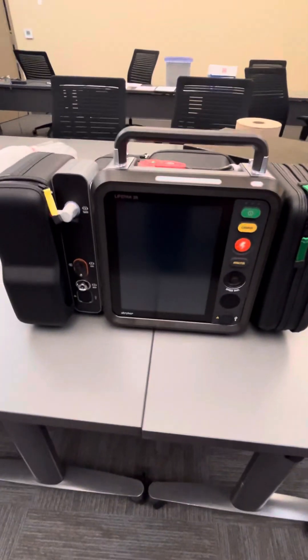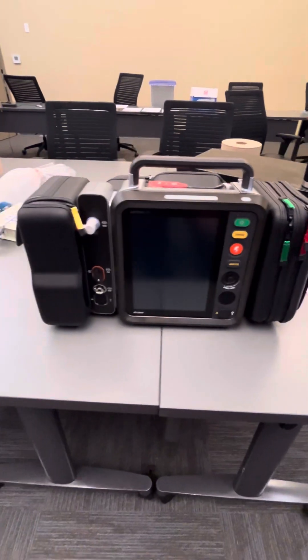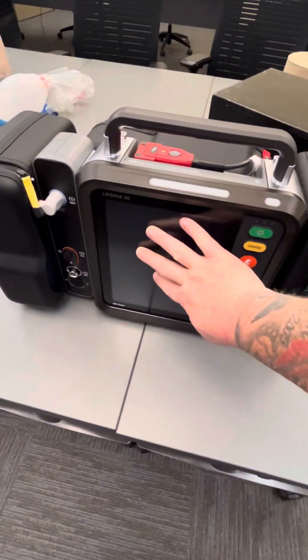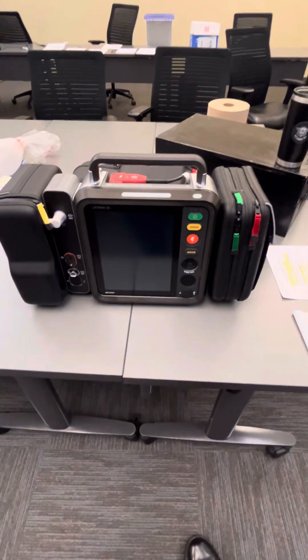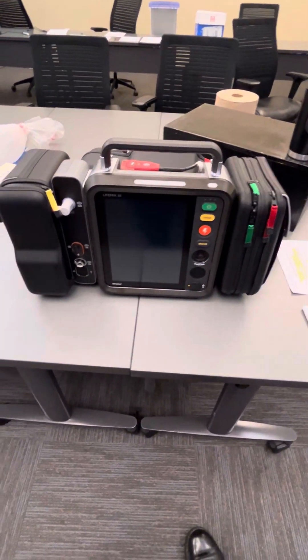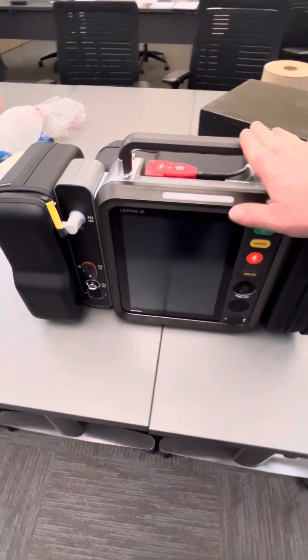You'll notice there are some similarities and some differences compared to the LifePak 15 that we're used to. The first thing is the screen — it is all touchscreen. An important note: do not use bleach on it, as it will degrade the screen and break it down over time.